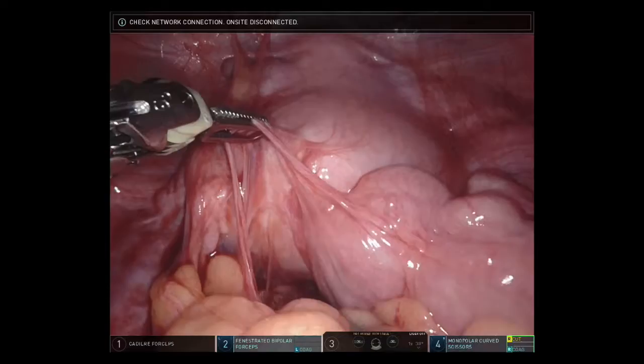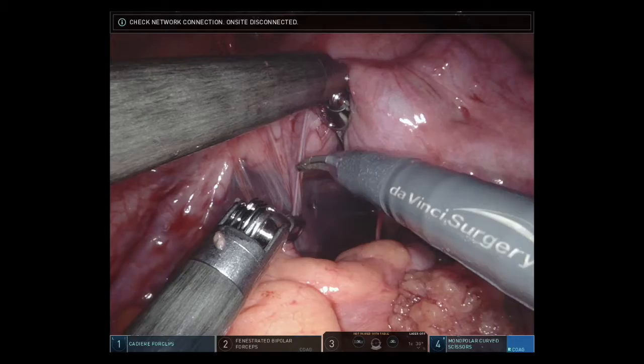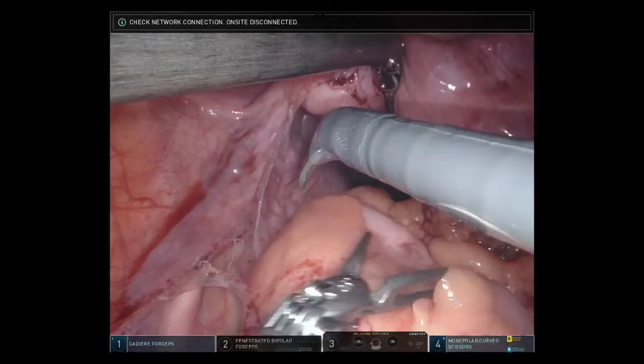Our initial view with the laparoscope demonstrated extensive pelvic adhesions to the bowel, gynecologic organs, and the left lateral pelvic sidewall. These adhesions were taken down with a combination of electrocautery and sharp dissection.